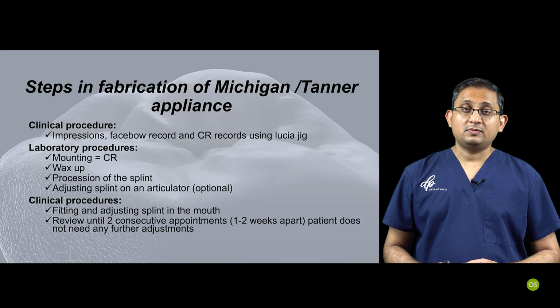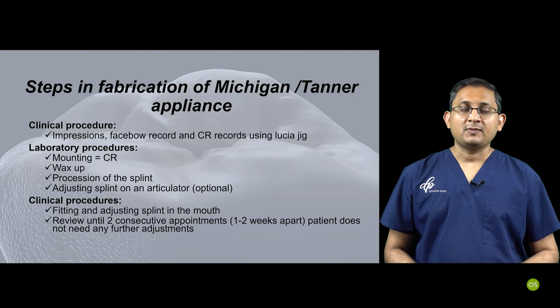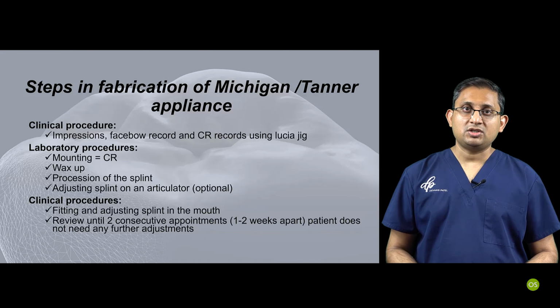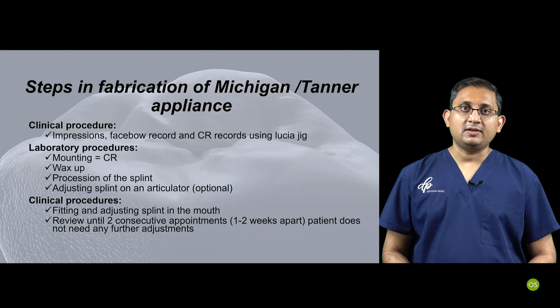However, newer articulators are much better calibrated, so if you buy two articulators from the same company, they should both match the mounting, so you can technically interchange the mounting. However, in my opinion, if you want to study occlusion, it's better to mount and assess on the same articulator.